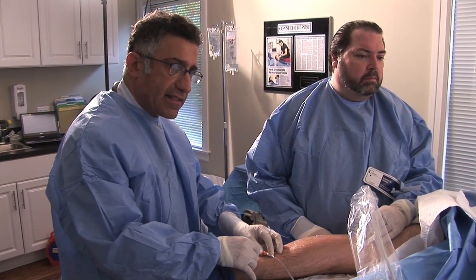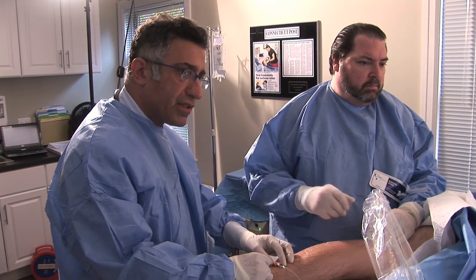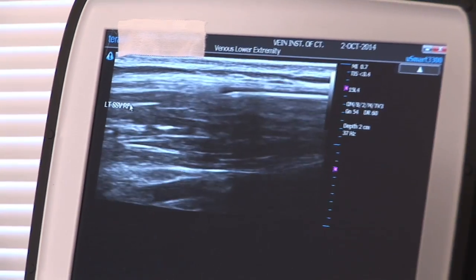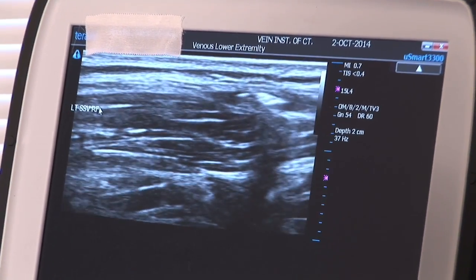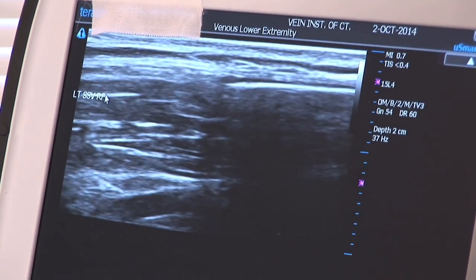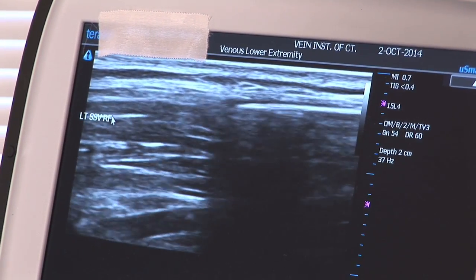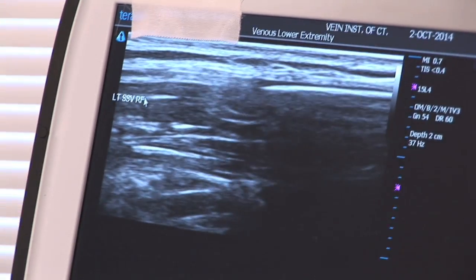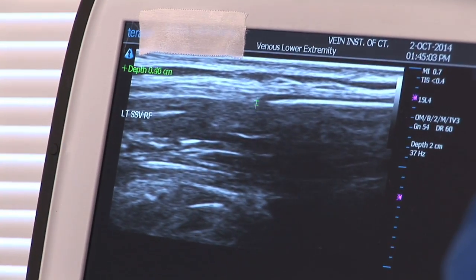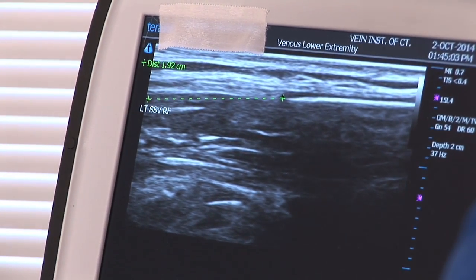Now the radiofrequency fiber is inserted to a certain anatomical location depending on where the junctions are, where other veins are, and how long the length of the vein is. What you're seeing moving forward and backwards is done to illustrate what the fiber looks like on the ultrasound. This is the fiber, and the black area around it is the vein that's on top of the monitor. Now we measure the tip of the fiber to a certain anatomical location to ensure safety.